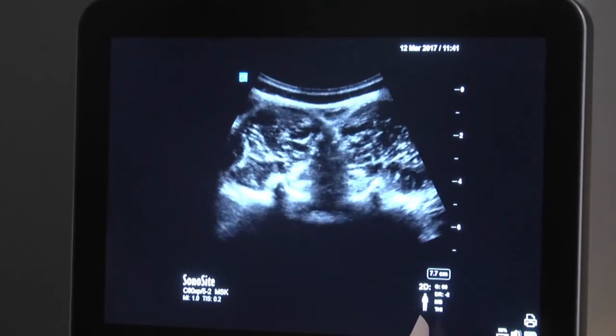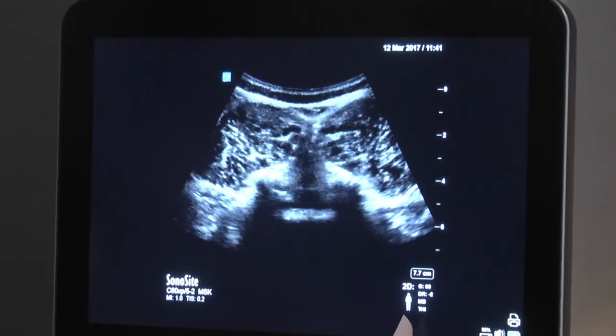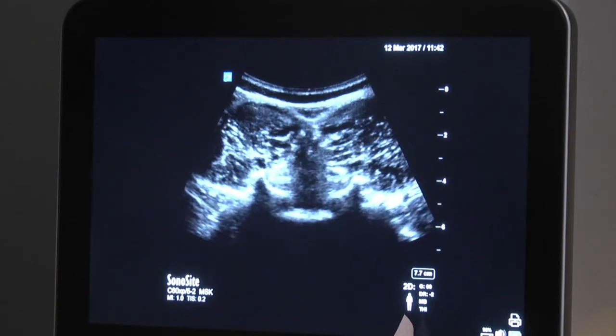And then we look for the interspinous scan, see? Okay? Right? It's so close. See, it's just a case of moving it back and forth. And this you already know. This is the interspinous space. You can see the articular process.